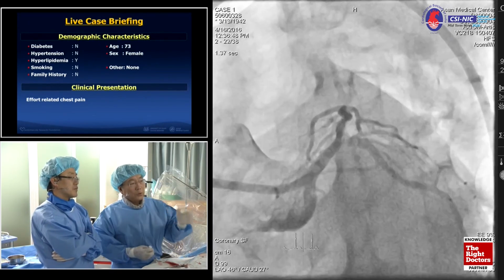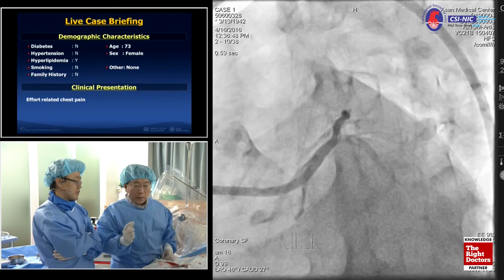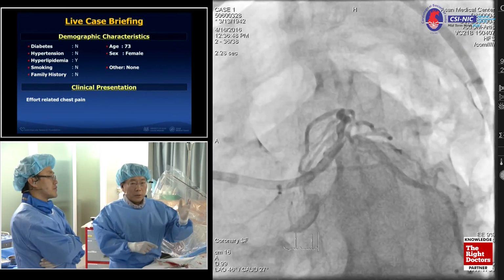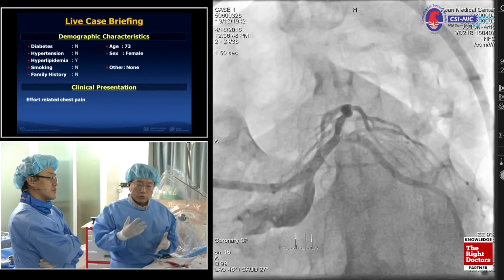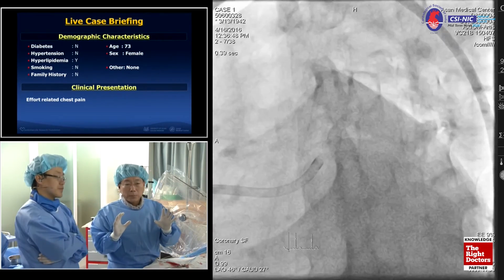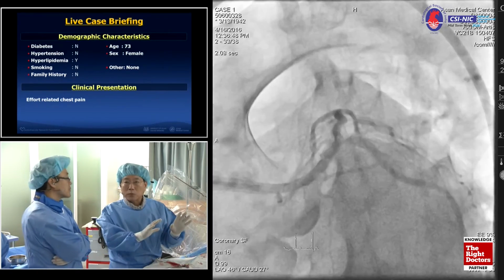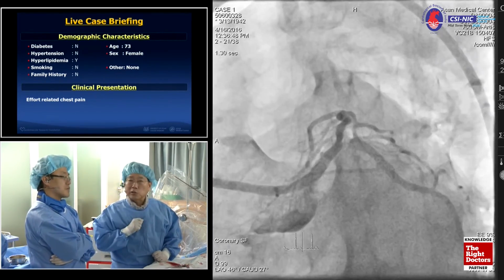And so up to this point, we have some very interesting data. Many kinds of two-stent technique, you know, currently we use mini-crush, culotte technique, the T-stent, TAP, any two-stent technique. So we can make a good clinical outcome using the IVUS-guided optimization concept. Whatever two-stent technique you choose, even dedicated two-stent, after the two-stent, how big the stent area is, is the most important key predictor for good clinical outcomes.